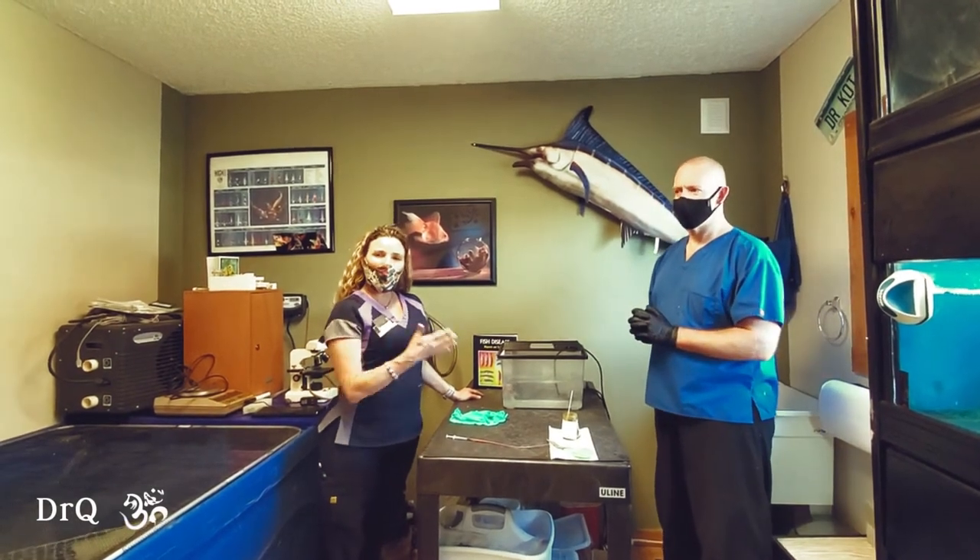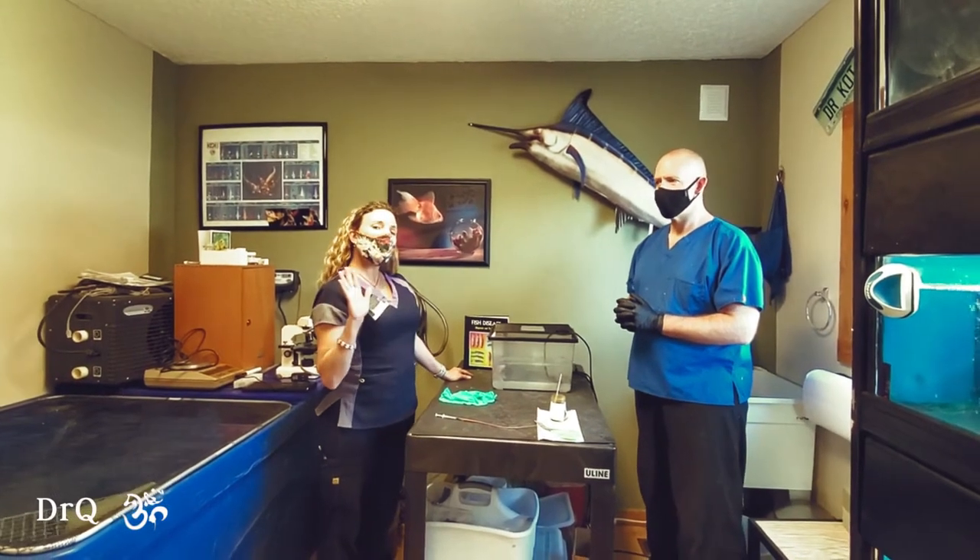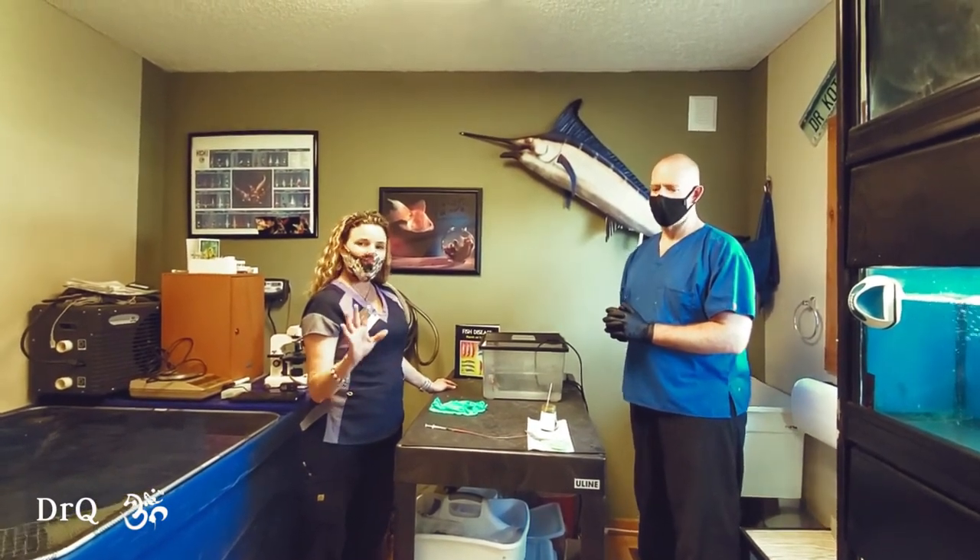Hi everybody, it's me, Dr. Q from our fish room here at Aspen Park Veterinary Hospital. And today what I'm going to show you is how to force feed a fish.